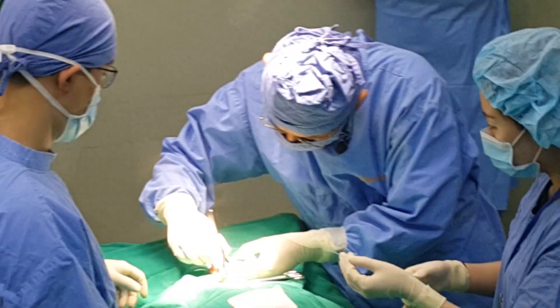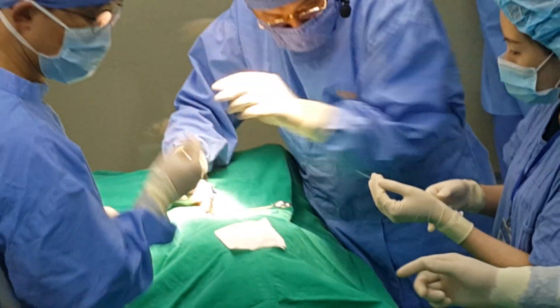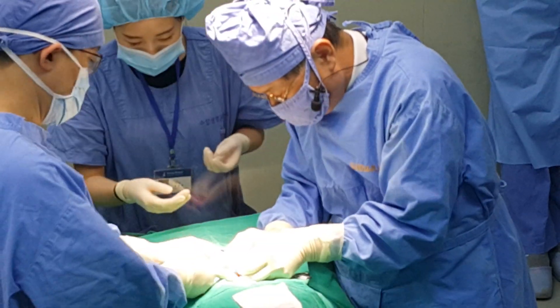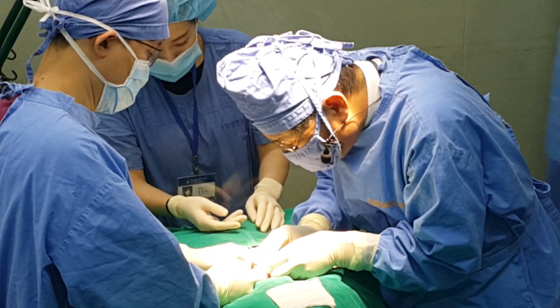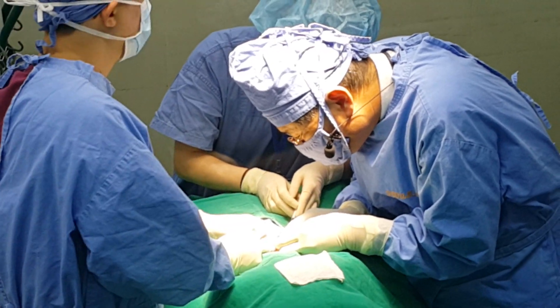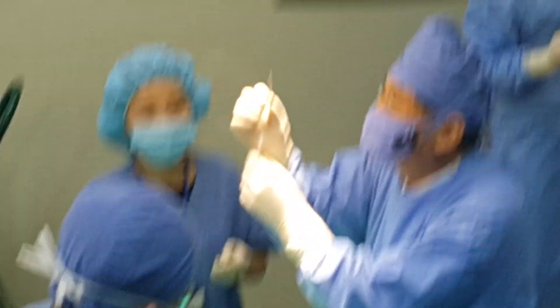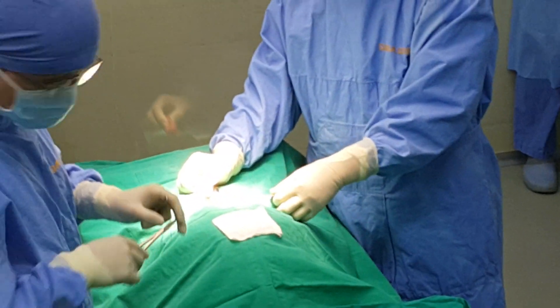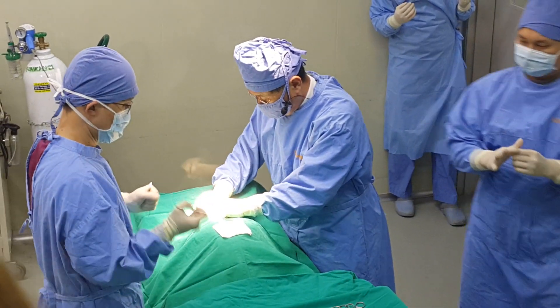You can see the syringe — that's the embryos. Now he's implanting. We're going to verify if all of the eggs have been transplanted from the screen. As you can see, all of the eggs have been inserted. And with this, we're done with the embryo transfer process.